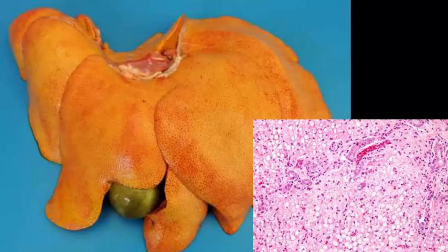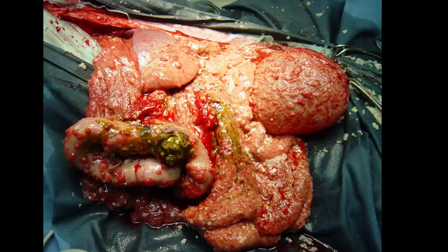Okay, 1, 2, 3, 4, 5, 6. Question number 7. Oh, the answer to the last question was in Judd and Kennedy, Volume 2, pages 547 to 551. And here we are at a dog. This is a surgical picture. Okay, I don't know any pathologists that use drapes for autopsies. So this is a surgical picture, and this is tissue from a dog. Can you name the cause?